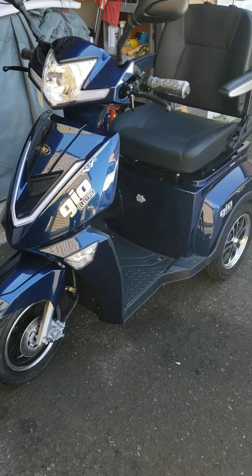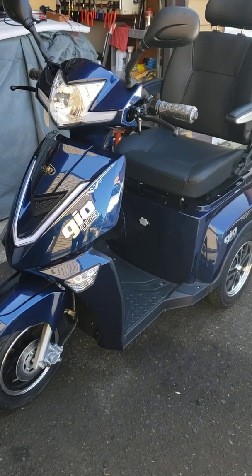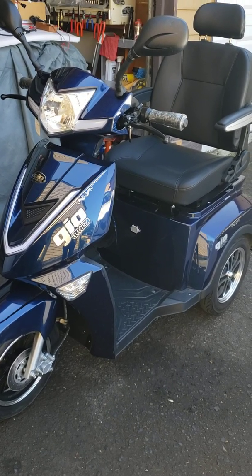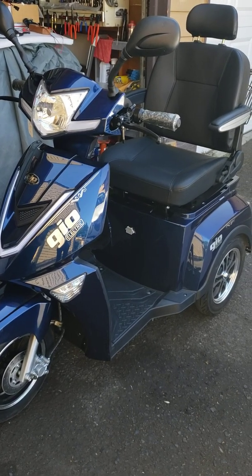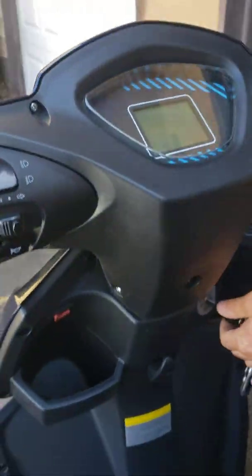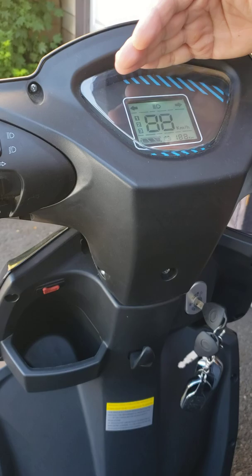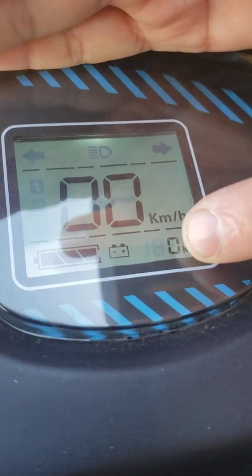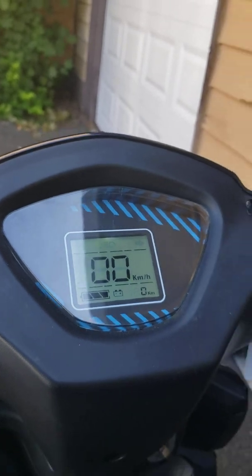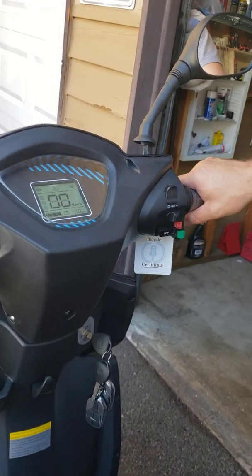Hello guys, so on today's video I want to show you how you can diagnose your mobility scooter if it's not moving. So if your battery is fully charged, you turn on the ignition, and you see on the battery display that it shows full battery, but you twist on the handle and the machine is not moving.